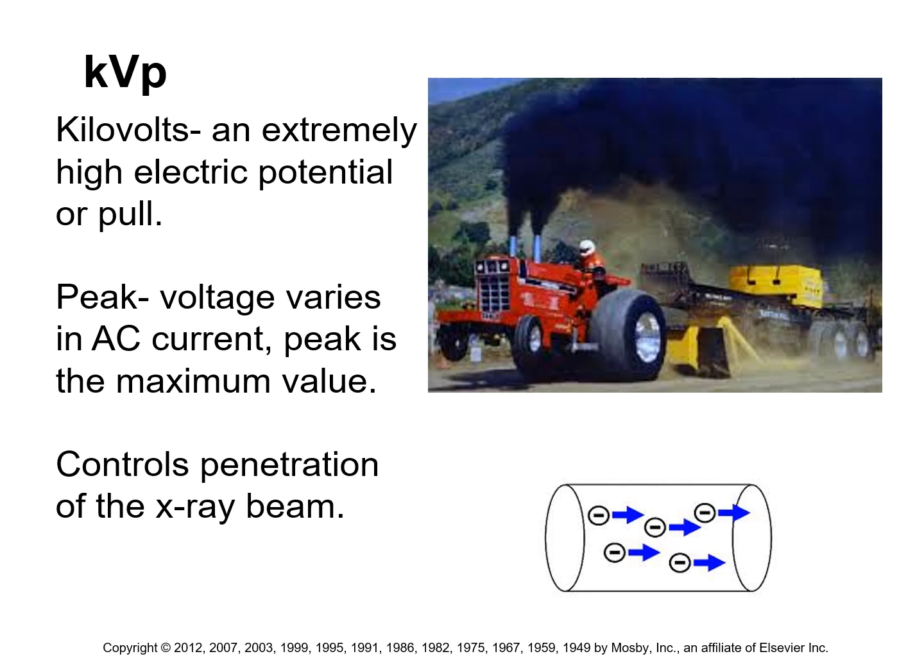Okay. Now, kilovoltage, it's not really power like you would see in a tractor pull, but that's the closest iteration I can. Kilovoltage is what we call penetration power. We also call it electric potential or pull. It's the amount of force that the electrons are experiencing, literally.